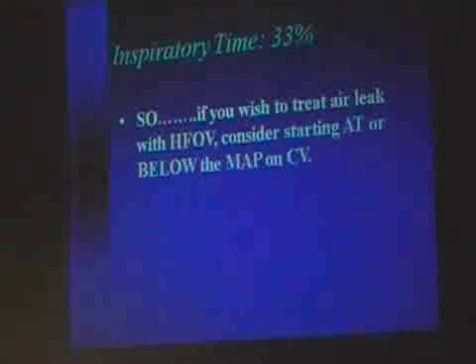If you wish to treat air leak with oscillation, remember that with air leak you want the lowest pressure that you possibly can have. So if you wish to treat air leak, consider starting at a lower mean than on conventional. And even though we will talk later about the possibility of jet being a better machine for air leak, if you do want to use the oscillator, your mean needs to be lower than on conventional.